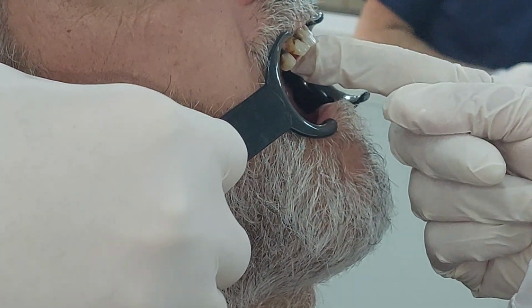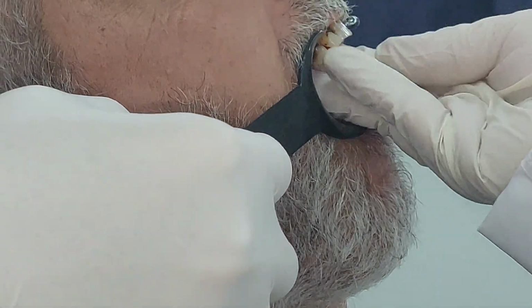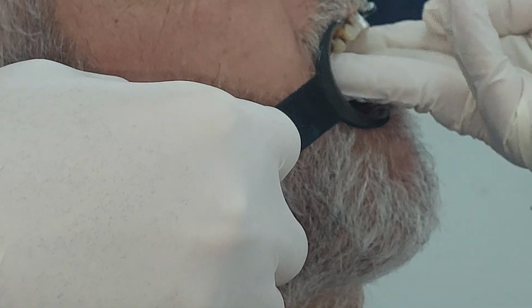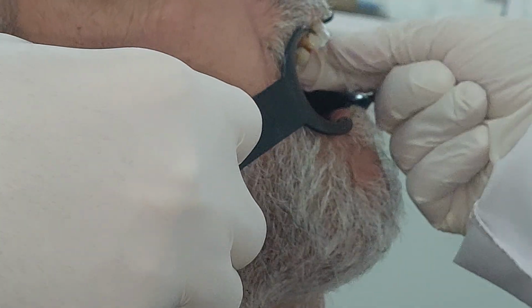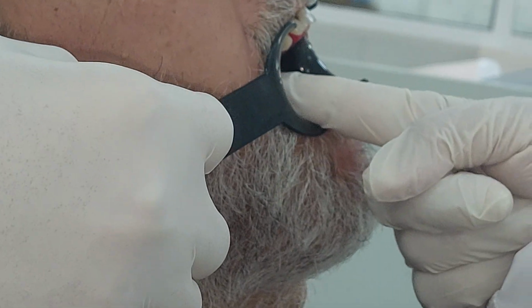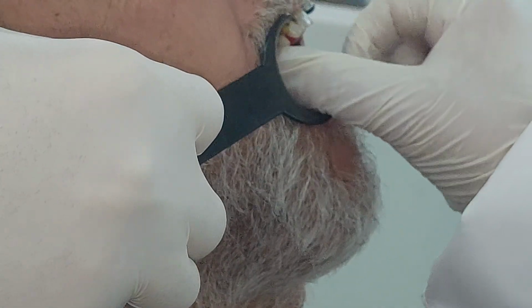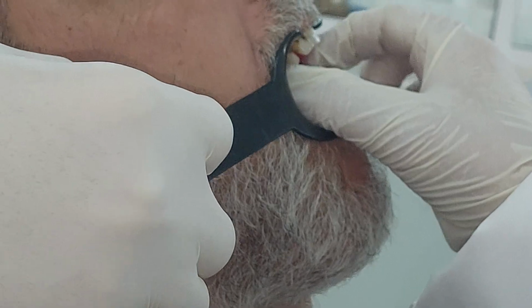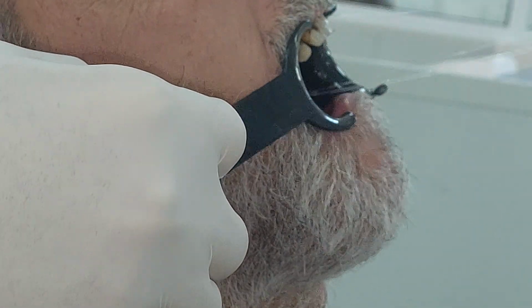plane. How do I exclude it from the Fox plane? I place the Fox plane all over, but I tilt it in a way it doesn't touch this tooth. Leave this slightly over erupted. Okay, so I have two options: either reshaping of this tooth, or excluding it from the occlusal plane. So I'm going to use the Fox plane to determine the vertical dimension posterior in the molar area. Once I finalize this, I adjust the lower until I reach the vertical dimension I've decided to produce. So this is how I decide the vertical dimension for this case.